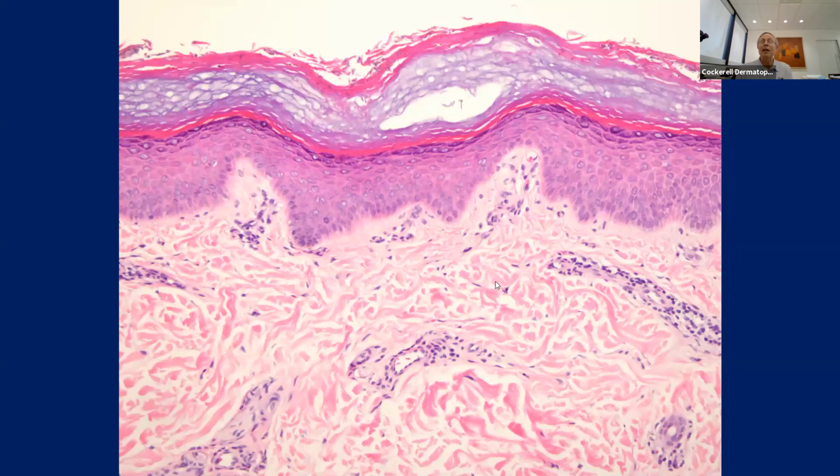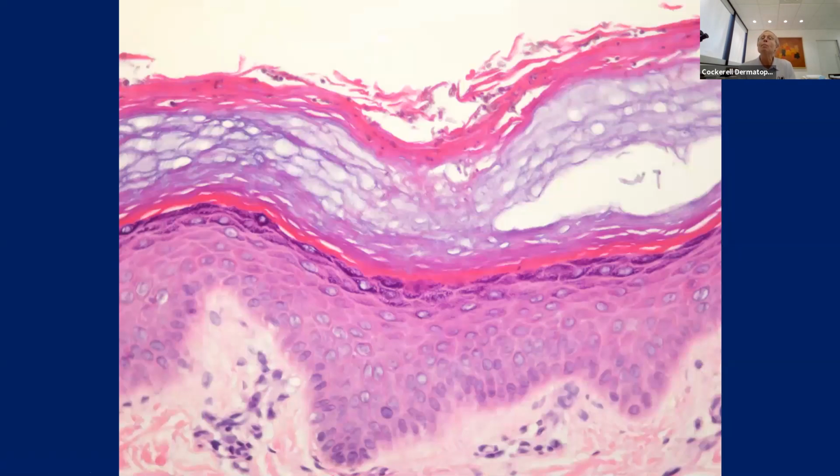So whenever you see a nothing biopsy, you work through things. So what other things might you think about? What if we didn't look in the cornified layer? We saw the superficial perivascular infiltrate around these blood vessels here with maybe a little bit of pigmentation at the basal cell layer. Yeah, TMEP. I hope you would think about that. That happens not to be the right answer, but still sometimes it's better to put something in the differential that it could be because you don't want to miss it. So good. In this case, you look at the cornified layer, and guess what? You see the obvious pigmented hyphae.